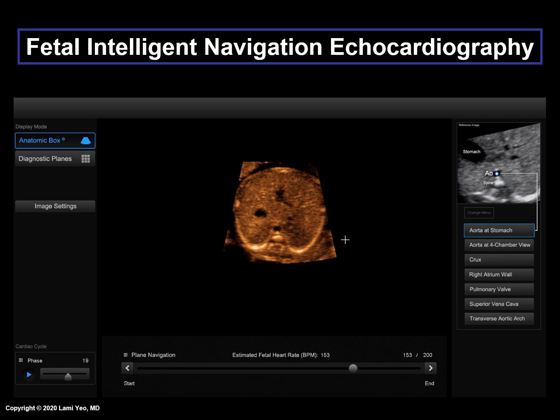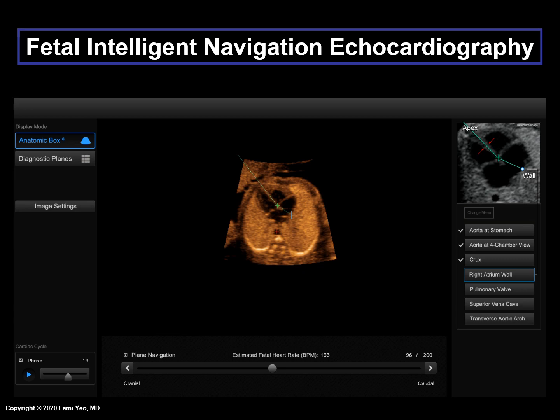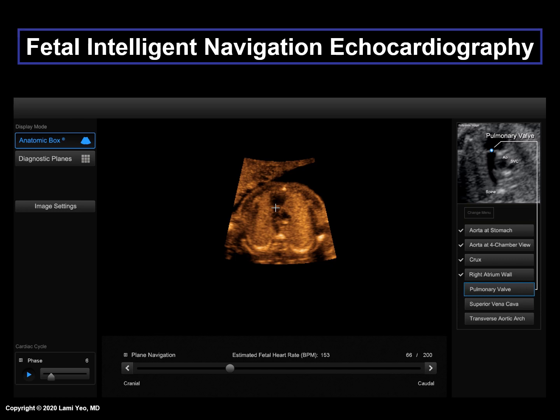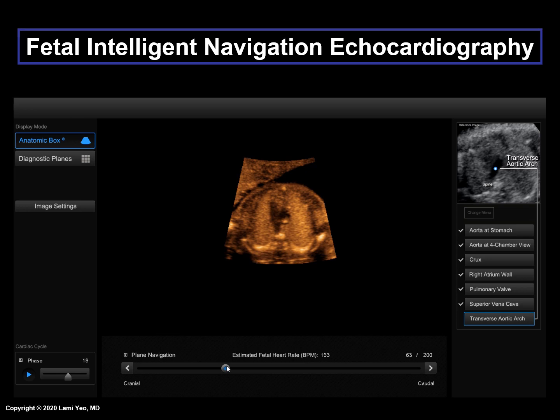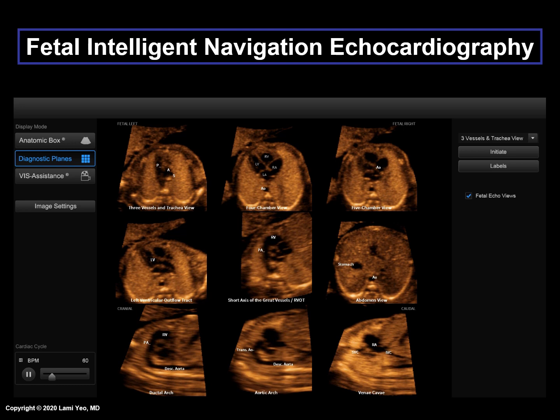The first structure to be marked is the aorta at the level of the stomach. Next is the aorta at the four-chamber view, the crux, right atrial wall, pulmonary valve, superior vena cava, and the transverse aortic arch. After these structures have been marked, within several seconds, all nine fetal cardiac views will appear at the same time, and automatic labeling is shown.